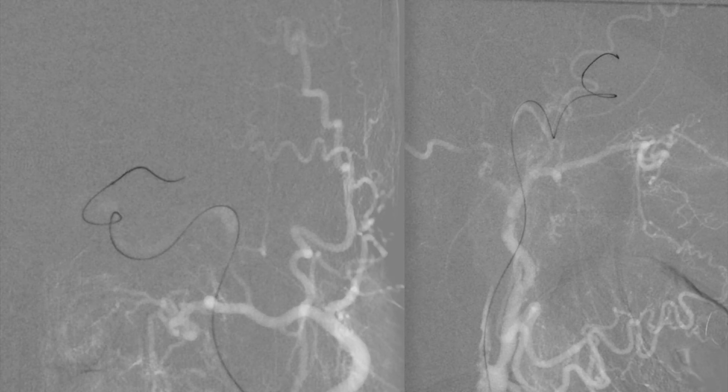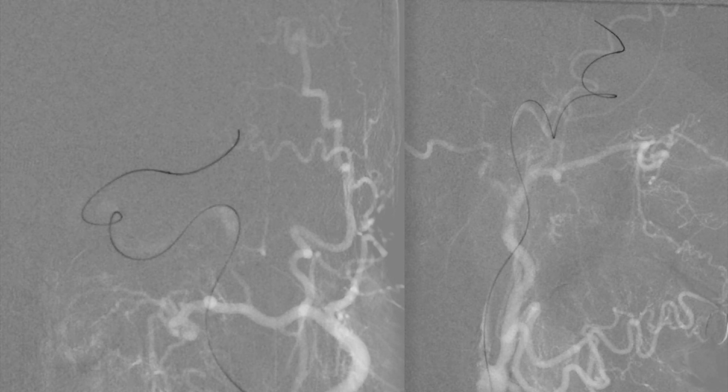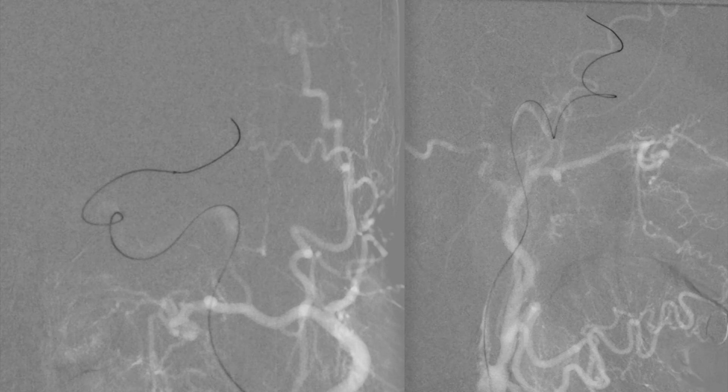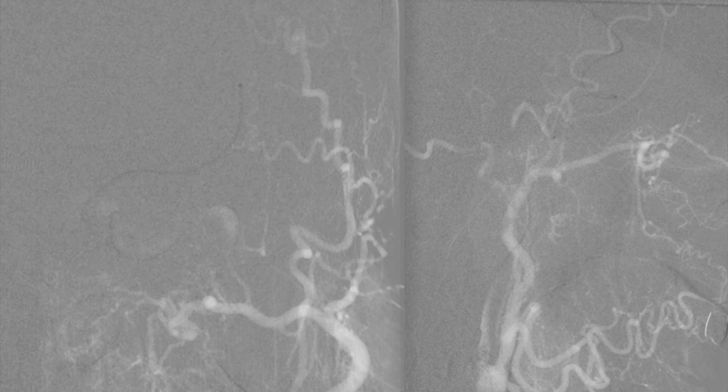As we continue in this case, you can see that we first navigate with a microcatheter through the cervical lesion using a microwire. As we usually do with the SAVE technique, we try to reach the inferior trunk of the MCA. You can see me navigate the microcatheter and microwire into the inferior trunk, and after pushing the microcatheter into the inferior trunk, I remove the wire, push a stent retriever through the microcatheter, and place it in the distal M1 and proximal M2.